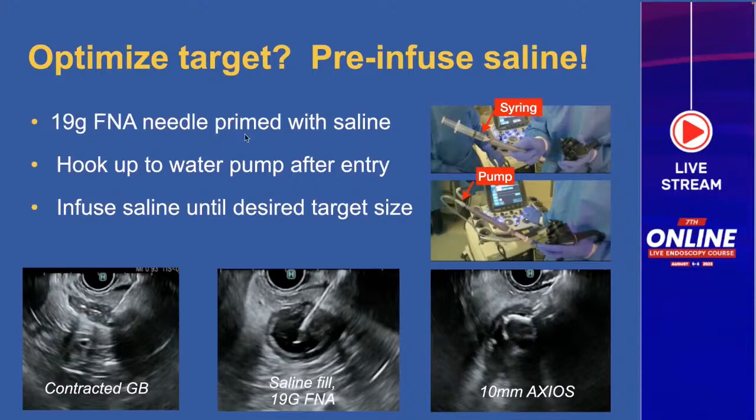Use a 19-gauge FNA needle primed with saline. Here you can see the syringe attached to the FNA needle primed with saline. After you puncture, hook up to a water pump and start infusing sterile saline until you achieve the desired target size. Here's a contracted gallbladder — this patient had a cholecystostomy tube and the gallbladder is contracted. You can distend it through the cholecystostomy tube, or alternatively you can puncture with the 19-gauge needle, fill it with saline, and then deploy your Axios in the new space you've created.